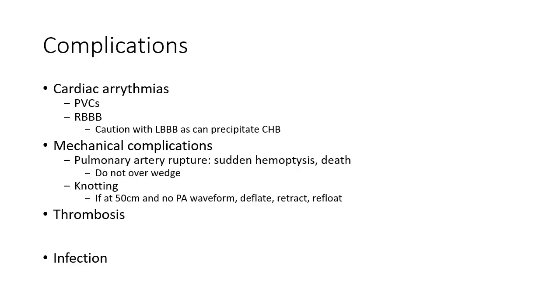Mechanical complications. So the feared one is PA rupture, very low incidence. It's less than 0.25% described in the literature. It's like less than 0.1%. But essentially, what happens is if one of those fragile arteries ruptures, either from over-wedging or let's say you inflate the balloon against force, which causes over-wedging, then that artery may rupture. Usually it presents with sudden hemoptysis, and then the patient precipitously dies. Although it can be rescued by emergent surgeries, it's a very bad outcome usually.